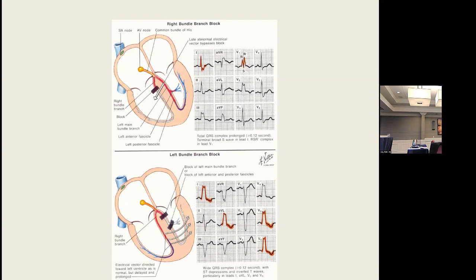is first identifying that the QRS is prolonged. The normal QRS is less than 2.5 boxes. Prolonged QRS is simply 3 boxes. That's 3 times 0.04, that's 0.12 seconds. If the QRS is just 20 milliseconds longer than it should be, you have 4 things in your differential: right bundle branch block, left bundle branch block, intraventricular conduction defect, or incomplete bundle branch block, or pseudo bundle Wolff-Parkinson-White. Let me show you all those disorders in a second.